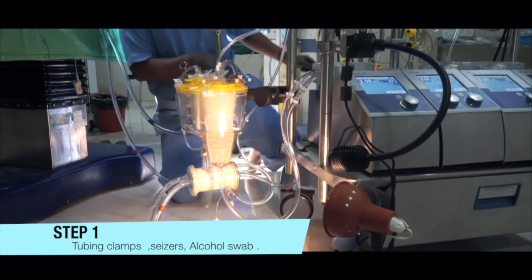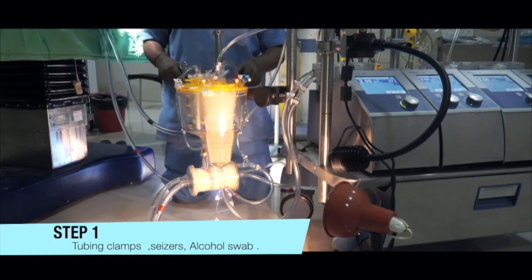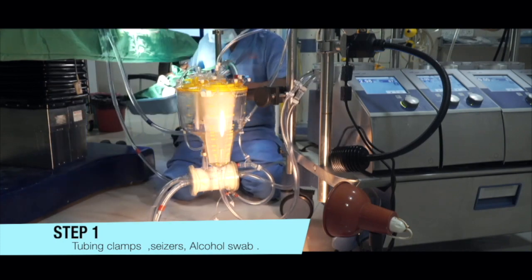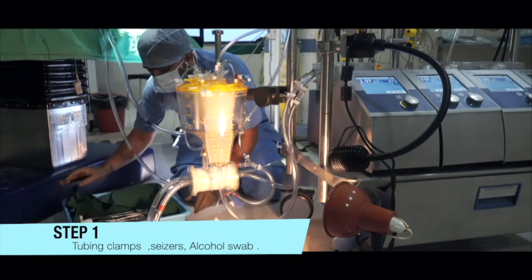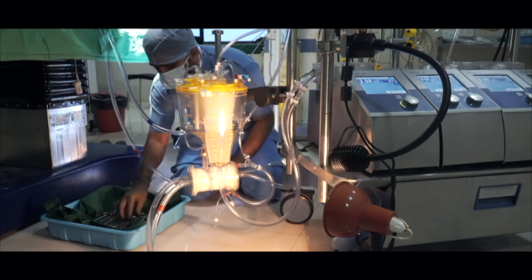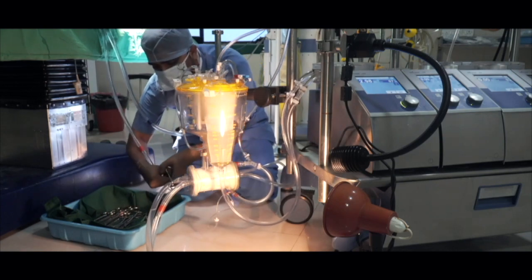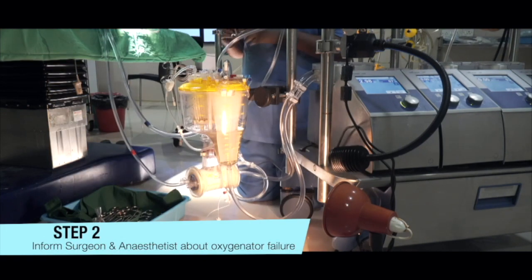Now I am going to tell you step by step how to change the oxygenator during CPB. Sufficient clamps are the key to the oxygenator changing procedure. Along with this, scissors and an alcohol swab are the most important to maintain sterility. In step 2, when you diagnose that an oxygenator problem is there, first inform the surgeon and anesthesiologist about the oxygenator failure.